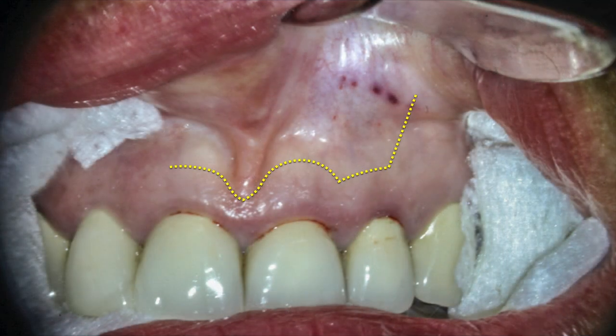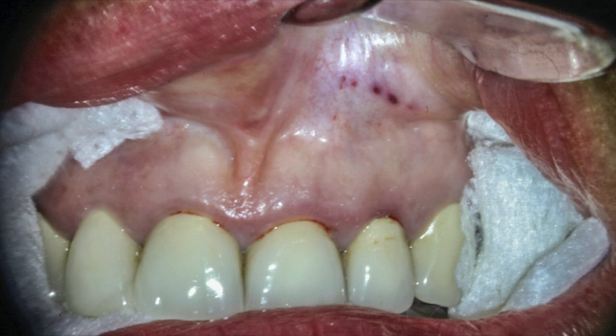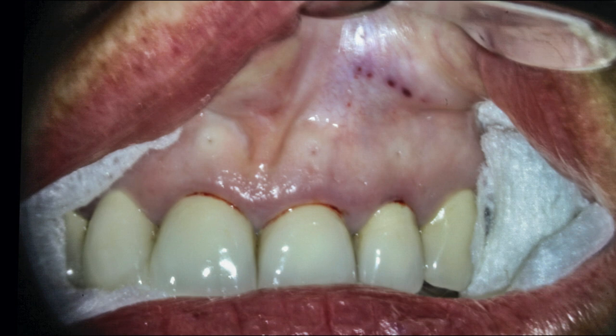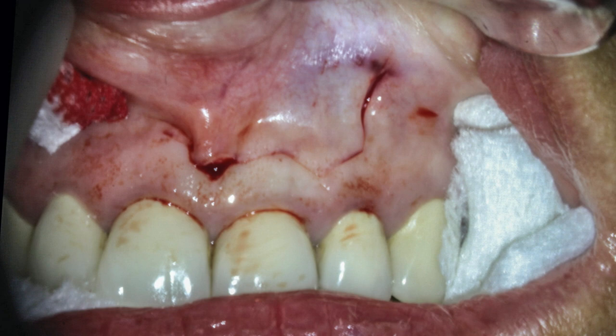This is the flap design that I came up with. It's typical for me to have the patient bite on a four-by-four gauze on the opposite side of the surgical field, and I'll pack the vestibules with some two-by-two gauze to pick up any heme during the process. Prior to making the incision, I take a periodontal probe and outline or mark on the gingival tissues the terminal position of the incision line. Once those areas are marked, it's a connect-the-dots situation — I follow and scallop the incision around, ensuring I stay within the bounds of alveolar bone based on the prior probing depths.